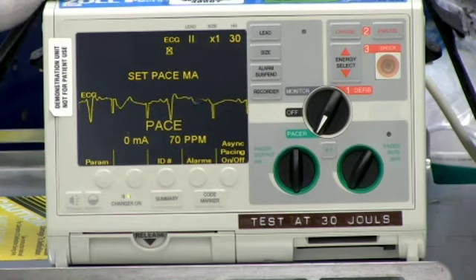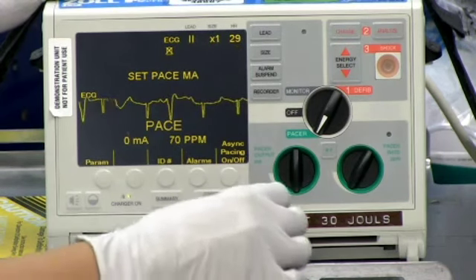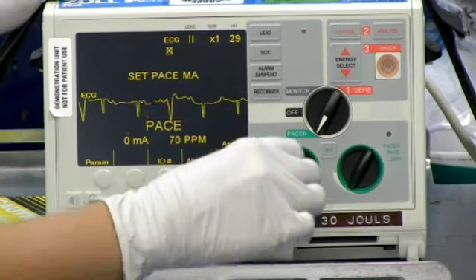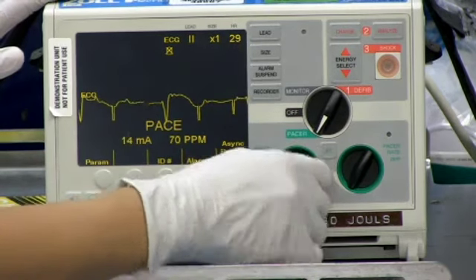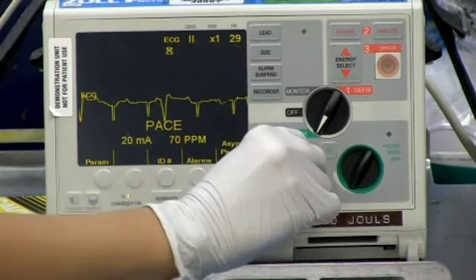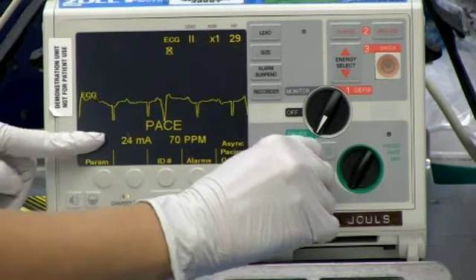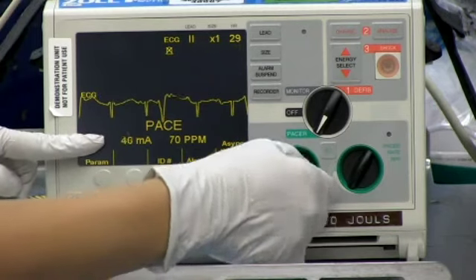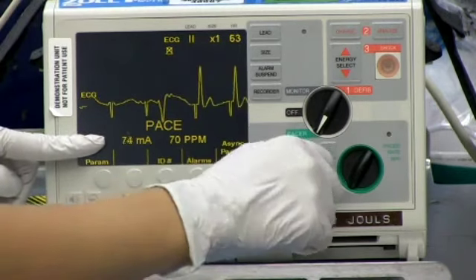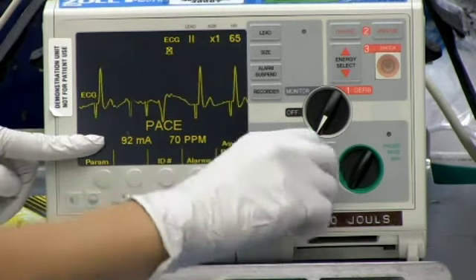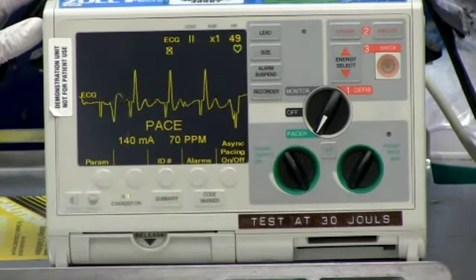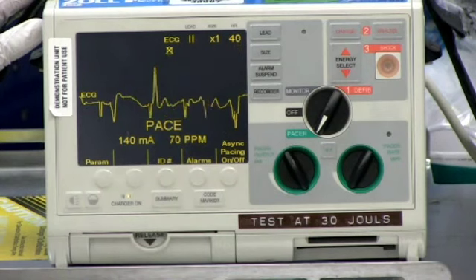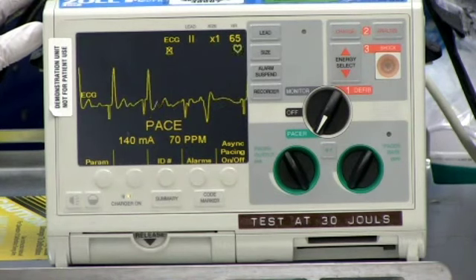Capture the heart rate. If the patient is in cardiac arrest with bradycardia or an asystolic rhythm, pacing should be initiated at the maximum current output to ensure that capture is achieved as soon as possible. After which time, the current can be gradually reduced to 5 to 10 milliamps above the threshold for capture.